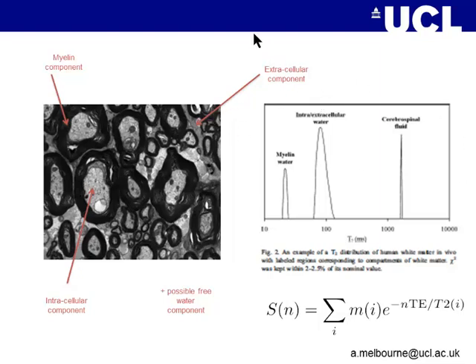And a method that is coming straight from the research, used in part in MS, is of course multi-T2 mapping. This is a micrograph of brain, and you can see that you have different elements. You have the intracellular components, you have a very strong, very huge myelin component here, and then you have a very small extracellular space. If you do some quantitative T2, you could use the equivalent of an inverse Laplace transform. There are different ways of doing it to separate the T2 contributions from the myelin water, the intra- and extracellular water, and the CSF, for example.